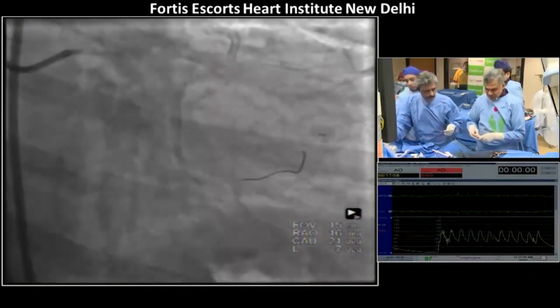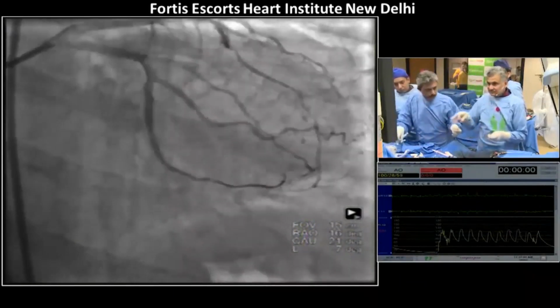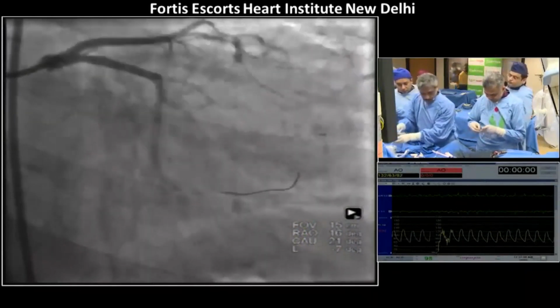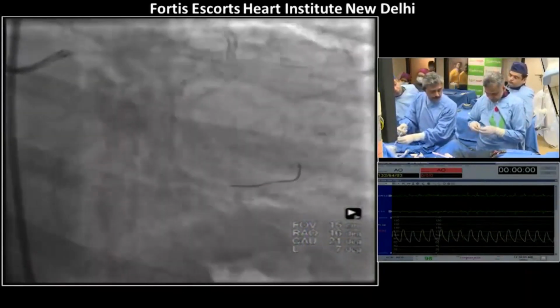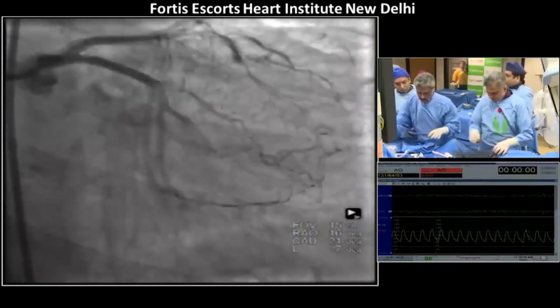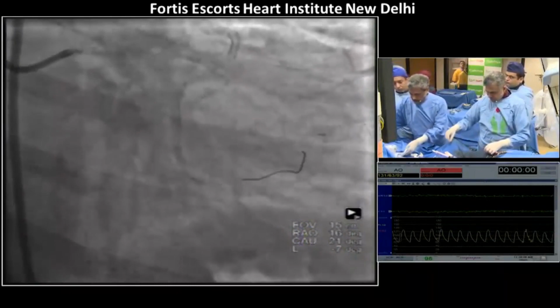We'll flush. Your IVUS. Flushing. Let's check whether you have a cover. All right.